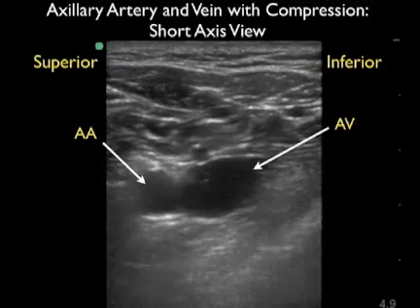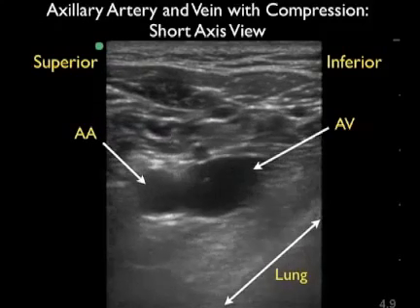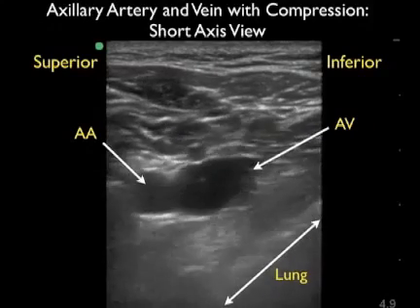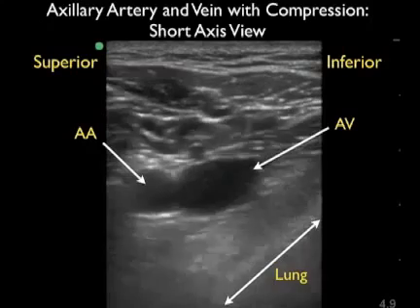Notice that as we apply probe pressure down onto the patient's chest wall, we can actually compress the axillary vein, and this is one way of telling vein from artery, as normally the vein should compress as long as there's no thrombus inside it and the artery will stay open.